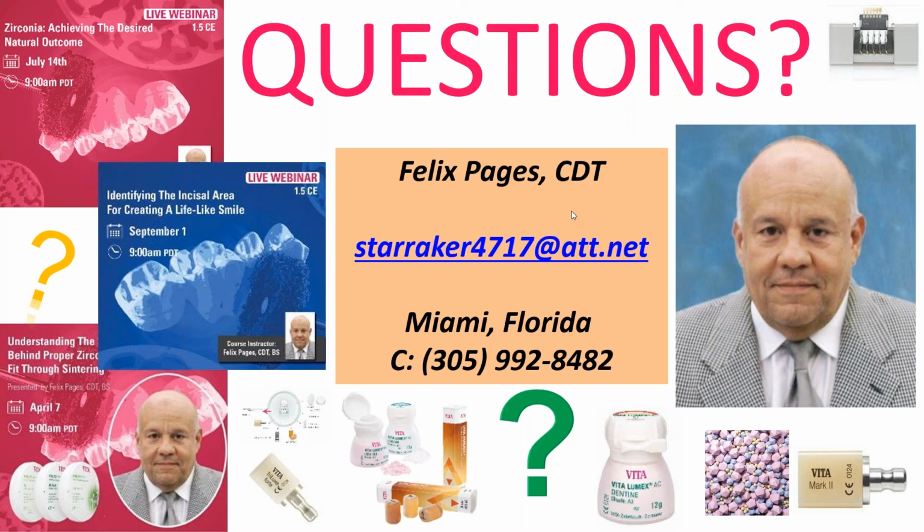And that study was done by Glidewell and Gordon Christensen, where they were trying to compare the surface of their brand new Bruxzir crown at the time, which is basically a 3Y crown, but they removed the alumina, okay? So by removing the alumina, you increase the translucency just a hair, but not to the extent of adding more yttria, you got me? And so what happens is, once they glaze those, Gordon did a study there, and you could see the glaze could wear off as early as 3 months, I think it was. But it's in the Glidewell study.